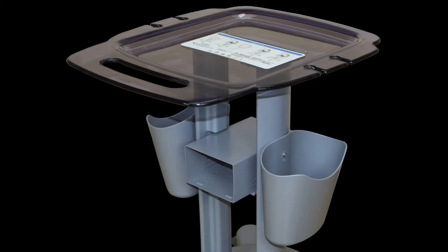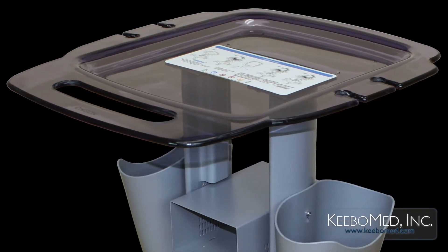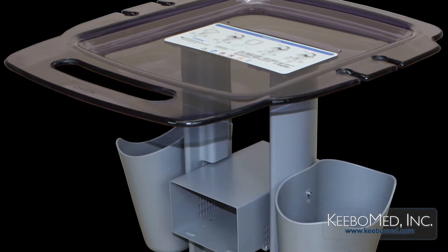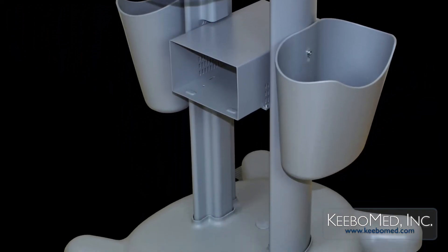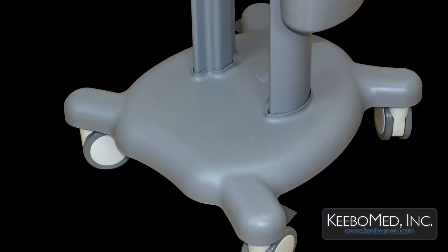The TR9000 Trolley from Chycin is the perfect solution for mobility and organization while using the Eco Series ultrasounds or other ultrasounds of similar size. This video shows an overall look and some of the important features of the TR9000.